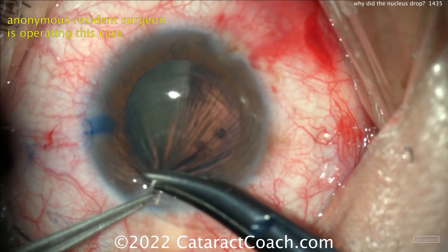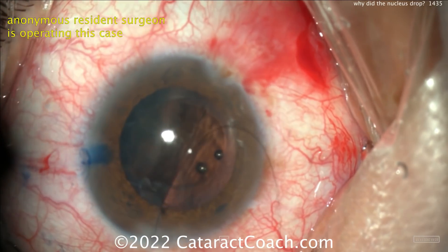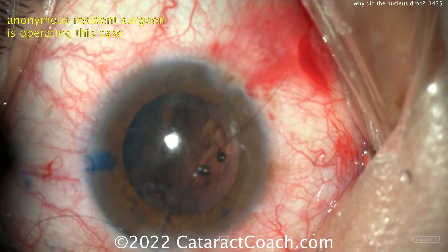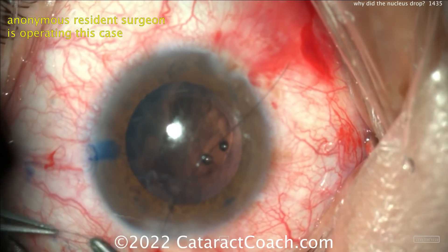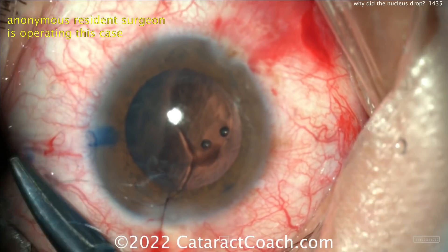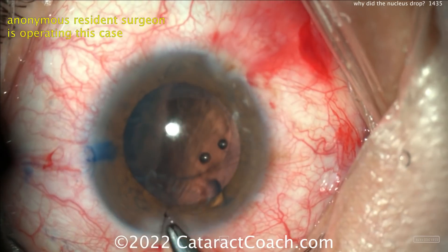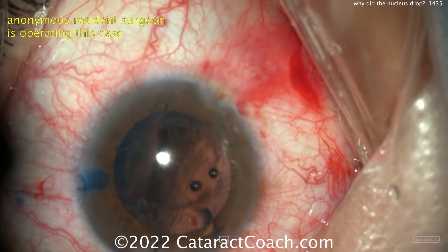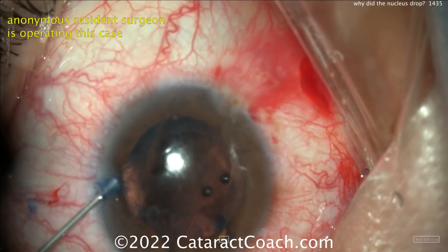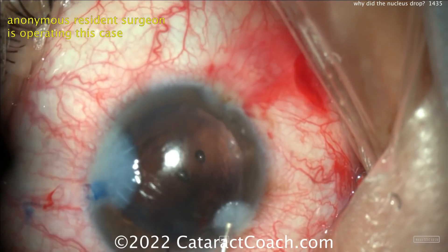Should you leave the patient aphakic or put a lens in? Either is okay. But if you're sending your patient to a trusted vitreoretinal colleague, that colleague can do the vitrectomy, lensectomy, and put the lens in for you. It's better to do no harm. I like the idea of placing a suture, then sending the patient aphakic to the retinal colleague who will help you out and continue this case. Remember, this complication happens to all of us — you just have to realize how to manage it. Your choice is to finish up and do a bimanual anterior vitrectomy, or just let the retina surgeon clean up everything.